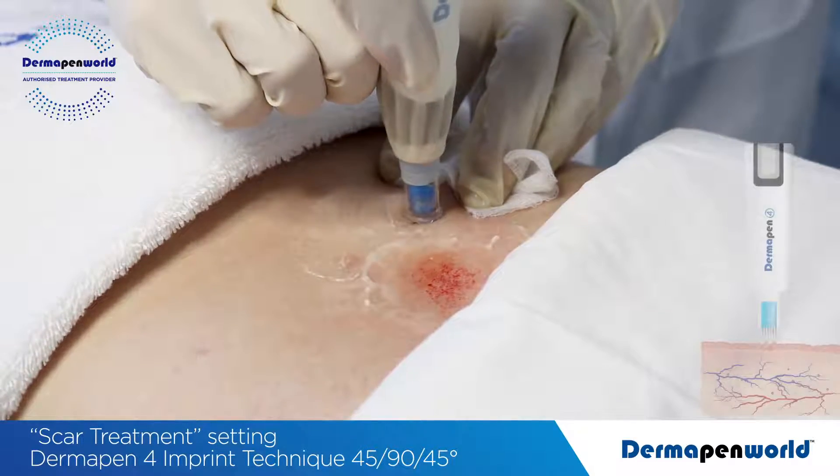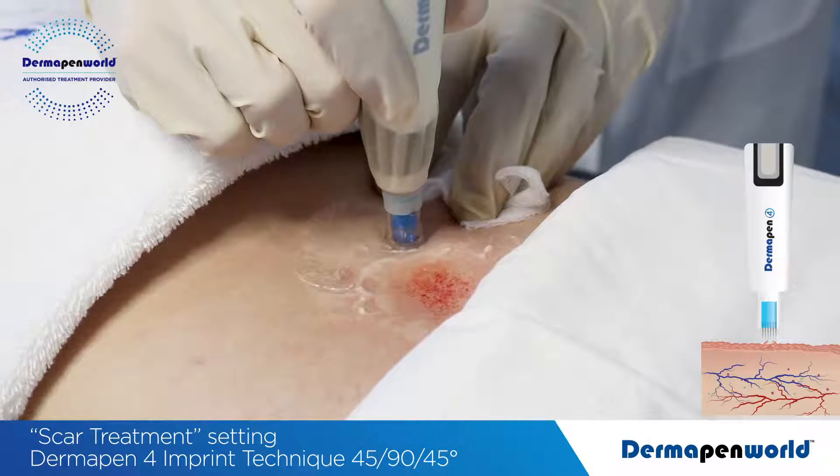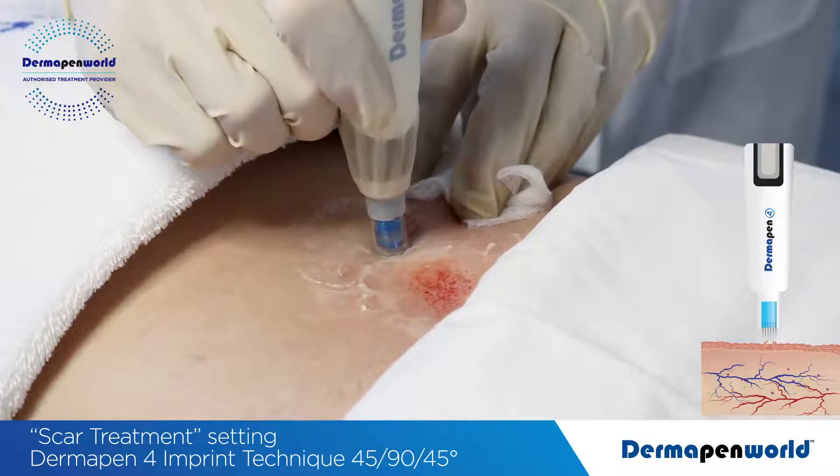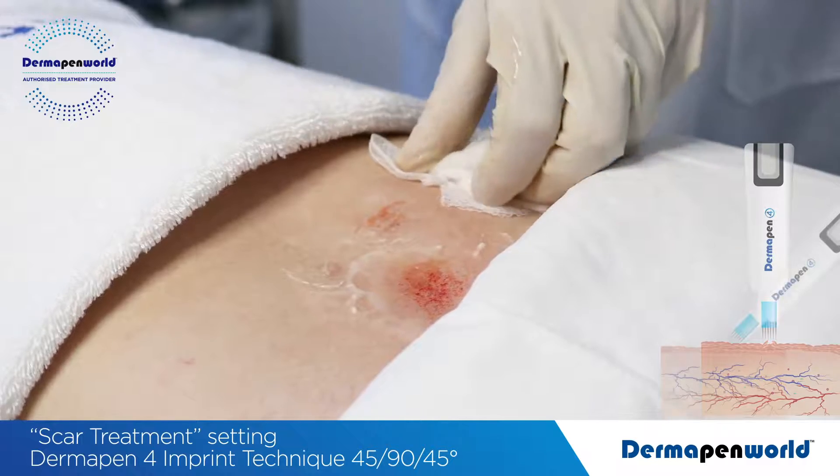At a 90 degree angle, hold into place for 3-4 seconds. Hold for 1, 2, 3, 4. We see some pinpoint blood coming through.